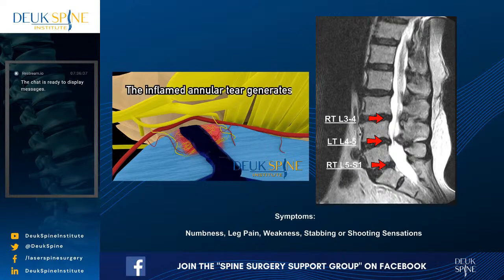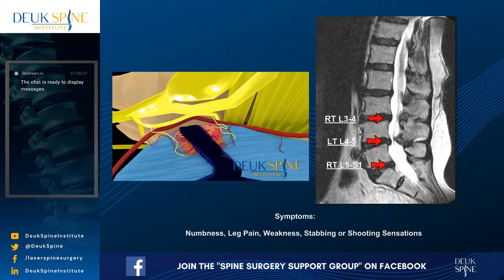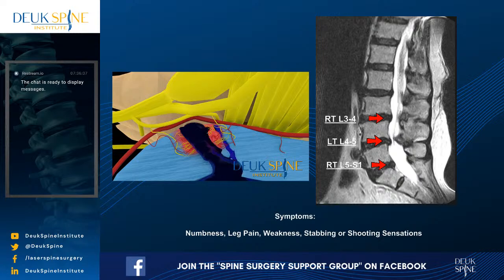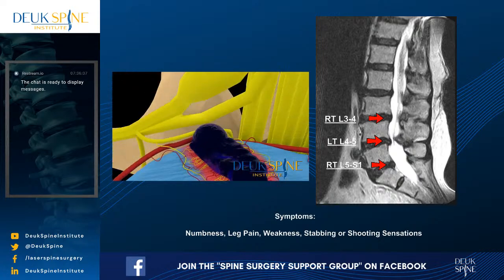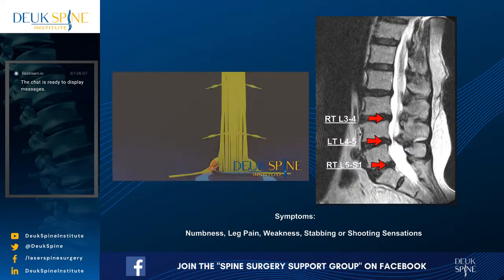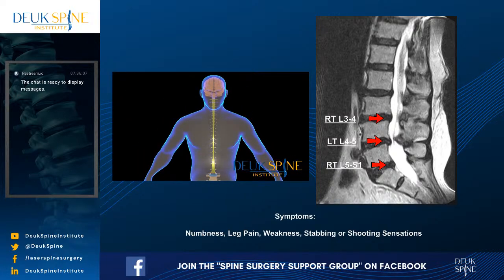All right. So left side is 4-5, correct? So we're going to be doing surgery on both sides. Just lay still. You're fine. That's the numbing medicine going in. I apologize. I know it's not comfortable. You're fine. Everything's okay, I promise. And then on the right side, it's 5-1 and 3-4, correct? Everyone's in agreement. A little stick and burn.